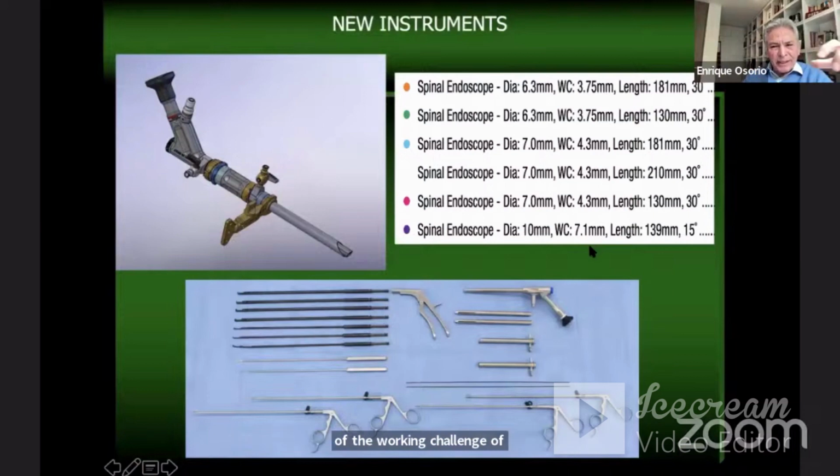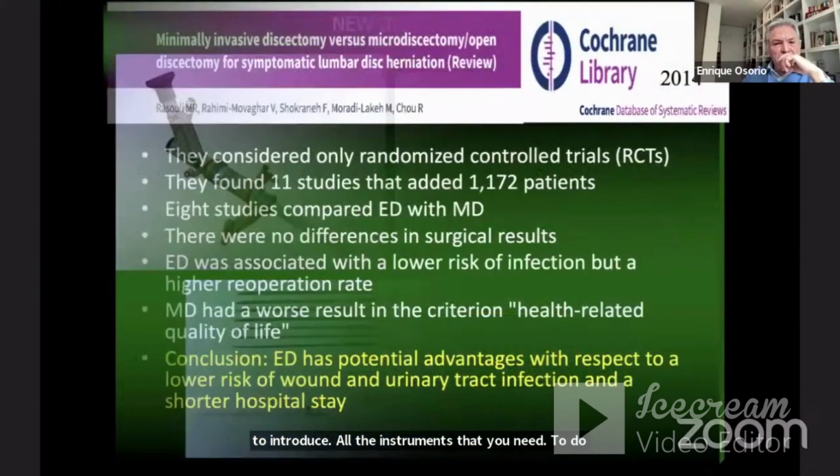That is very good because you have the possibility to introduce all the instruments that you need to do a very good microdiscectomy and also other procedures.